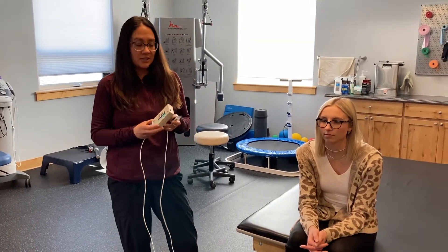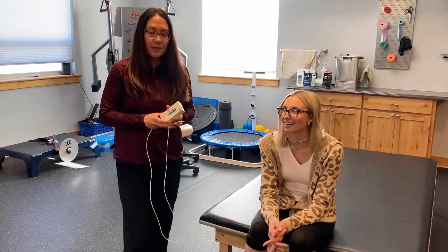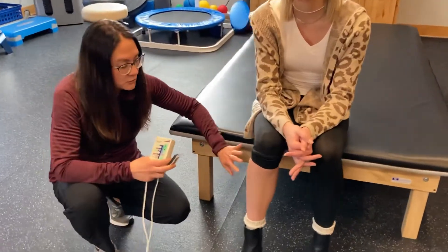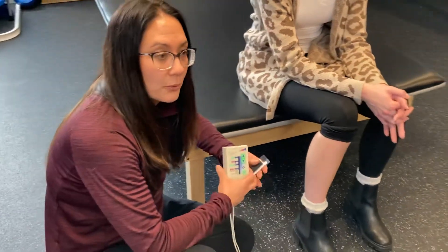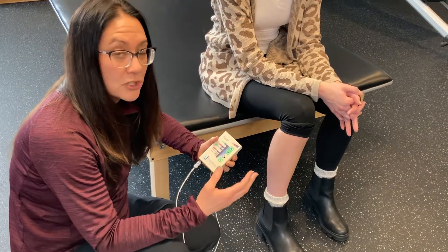We're going to use this today — I have Sassy here, she has kindly volunteered to demonstrate for us. We rehab a lot of feet and ankles after surgery or injury in the clinic, and what we find is that oftentimes after an injury, the lower leg will not be functioning properly. The brain has a hard time finding the appropriate muscles to stabilize that ankle and keep it functioning properly.